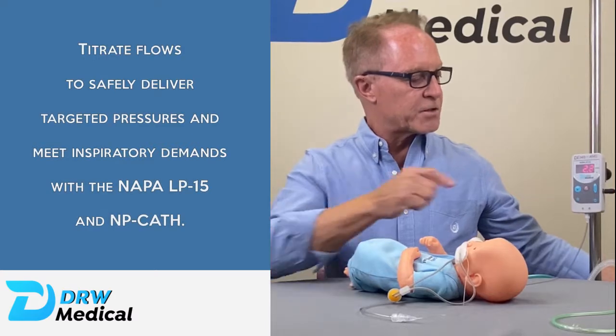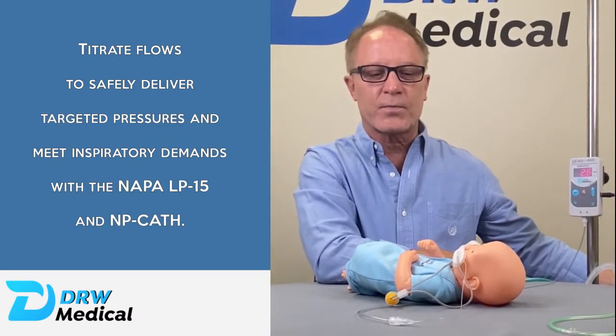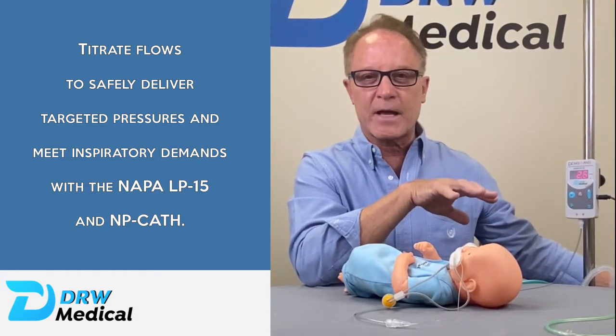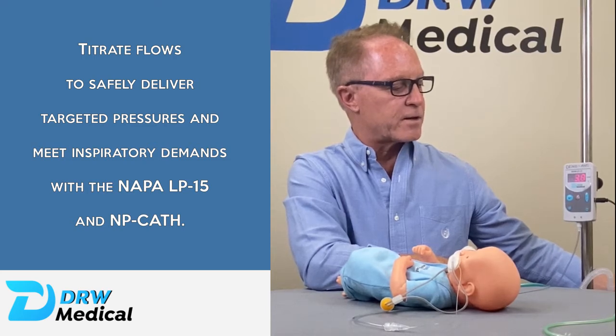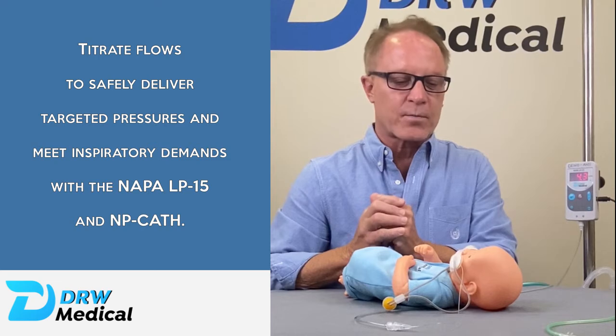So we're going to turn the flow up to about six liters, and as we go up you can see that we're at 2.6 centimeters of water pressure. So if I want four or five centimeters of distending pressure or dynamic CPAP, I can just turn the flow up to around six or seven liters. I'll say I want to hit a goal of four — so there are four centimeters of water pressure.